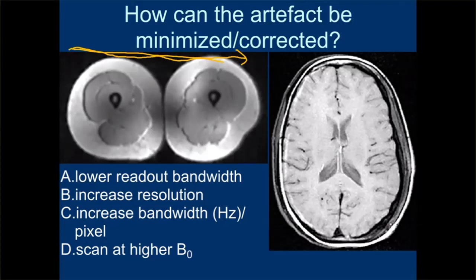Whereas if you do a phase encode, in the phase-encode direction, the phase at this time and the phase at this time is the same. So the phase is consistent along the phase-encode direction, but it is increasing along the readout, because it's evolving. Does that make sense? Kind of. The lecturer is moving too slow, and I don't think it's internet lag. Kind of, that's correct.